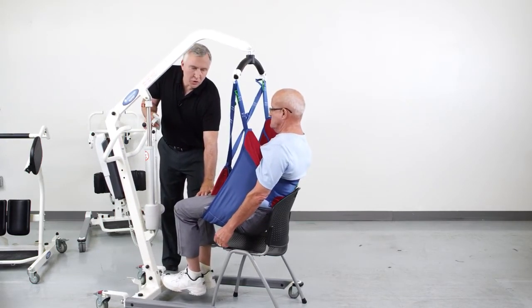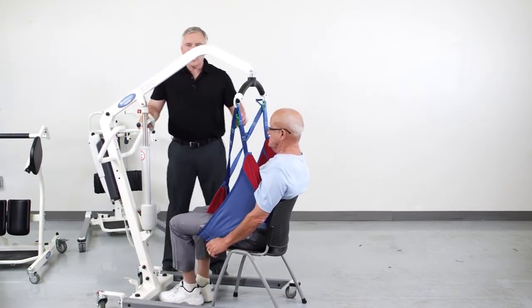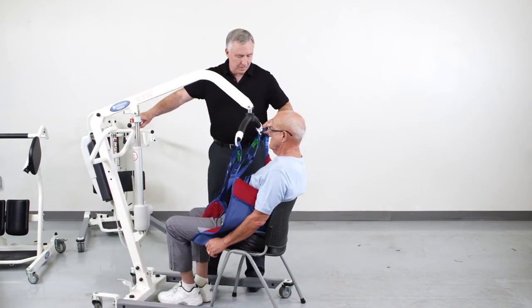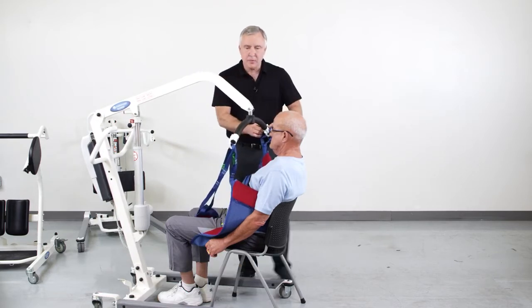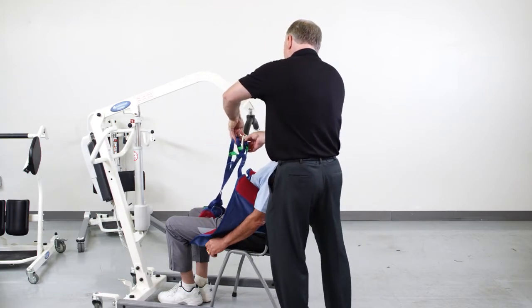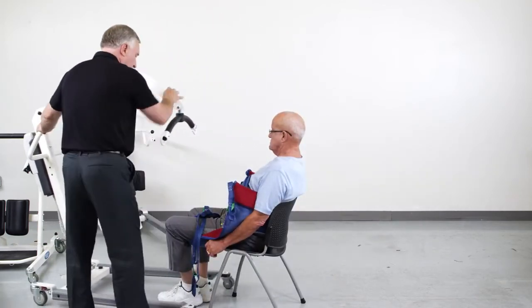This is to be used with caution on patients that still are able to go to the toilet that require total assistance for transferring. When an individual can no longer tolerate this type of transfer, then we use our full body sling and completely support them in the transfer process.